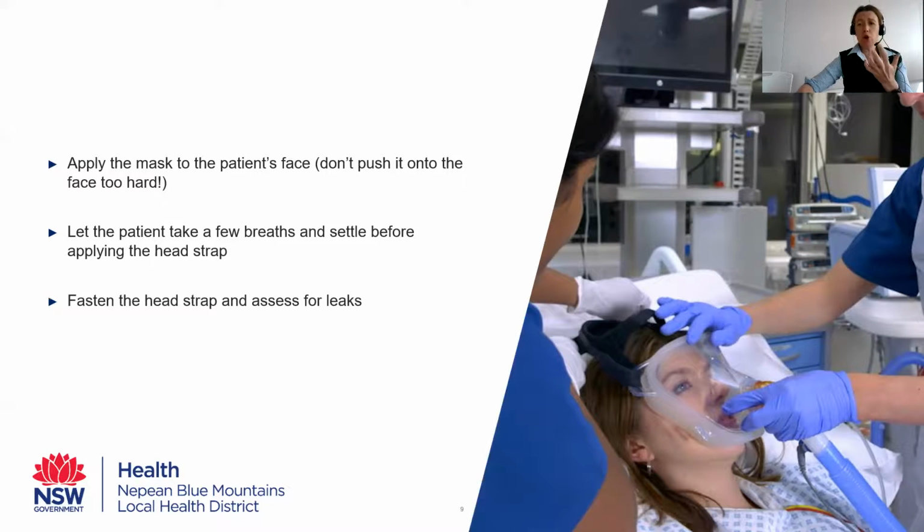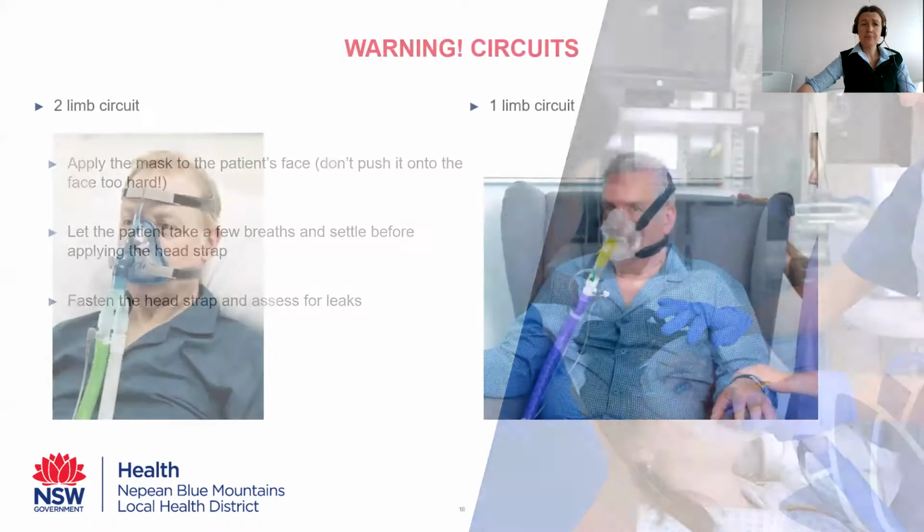So I just hold it with my hand until the patient is settled, and for some patients that's 5 or 10 breaths, for some patients that's 5 or 10 minutes. And then after that, I apply the head strap, fasten and assess for leaks.